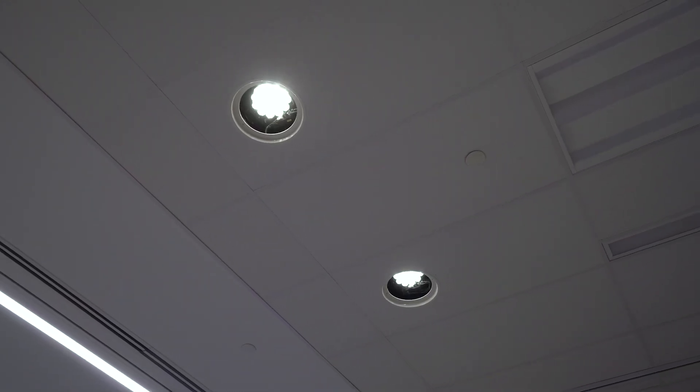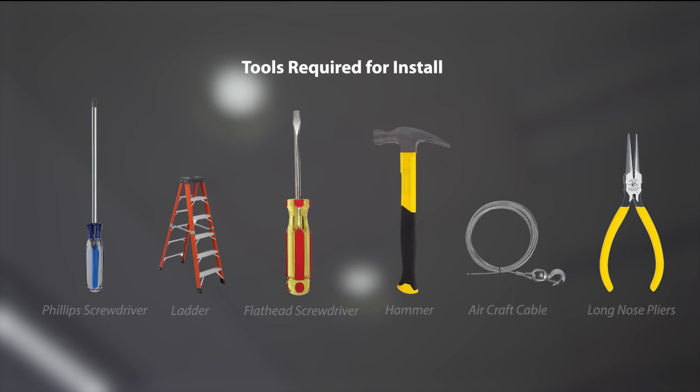Welcome to the Amico Lights showroom. Today we're going to be showing you how to install your new NOVA motorized exam light. Let's get started. Here are the tools required for your installation.